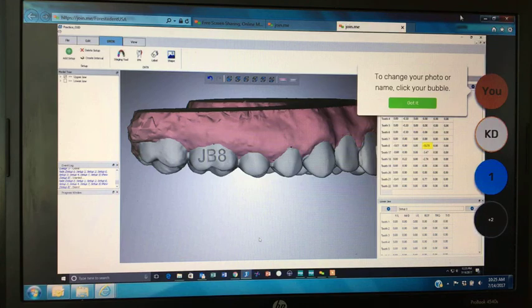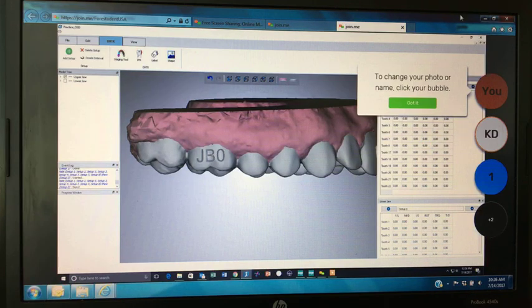Okay, that sounds great. The last question we have is for the labeling of the trays, and what he's asking is, when you do the first one or last one, does it automatically do the trays in between on each of those stages? With the labeling? Yes. So the labeling, you always want to start in setup 0. So if I arrow back here, after I've created all these trays, you'll always want to start in setup 0, because when you do that, the software will automatically label all the other trays. If you accidentally start, let's say, in setup 6, it's only going to label that one tray for you. And then you'd have to go back and do them all. So it's much easier if you just remember when using that label or even the shape, always start in setup 0.